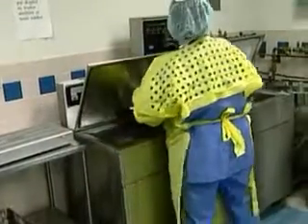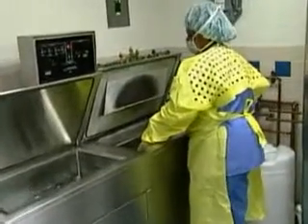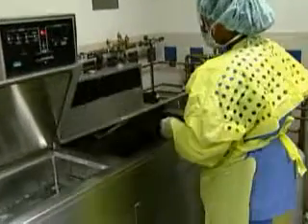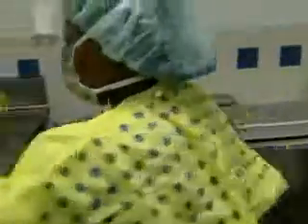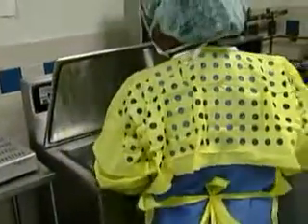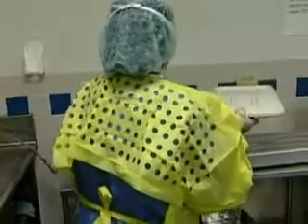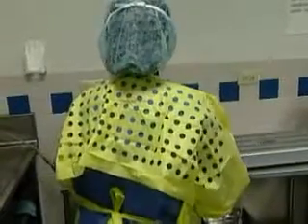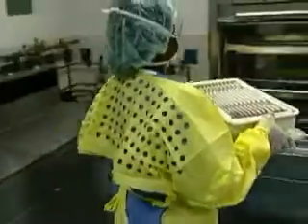Environmental controls and standard precautions can reduce personnel exposure to hazardous materials. Each employee working with contaminated goods must follow standard precautions required by the Occupational Safety and Health Administration based on the recommendations from the Centers for Disease Control and Prevention. Personal protective equipment should be worn in order to protect personnel from direct exposures to patients' blood, tissue, or body fluids.